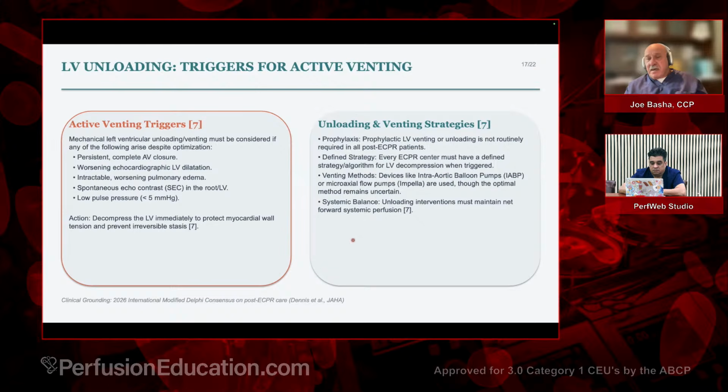Though it seems to be very common, because I think they go Impella first and then Impella is not sufficient, so then they go to ECMO. And I have to say this, I both like and dislike Impella. I like Impella because I think under certain circumstances it's extremely useful and a really good tool. I dislike it because I hear these reps say, "Oh, you don't need to do ECMO. You can do Impella. You should just do Impella in this case."